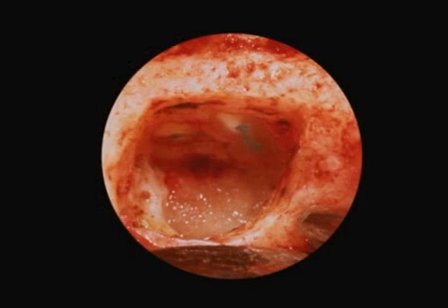This apical perforation required apicoectomy and retrograde type procedures. Note the management of the isthmus between the MB and ML foramina. The post-op film reveals the surgical corrective efforts.